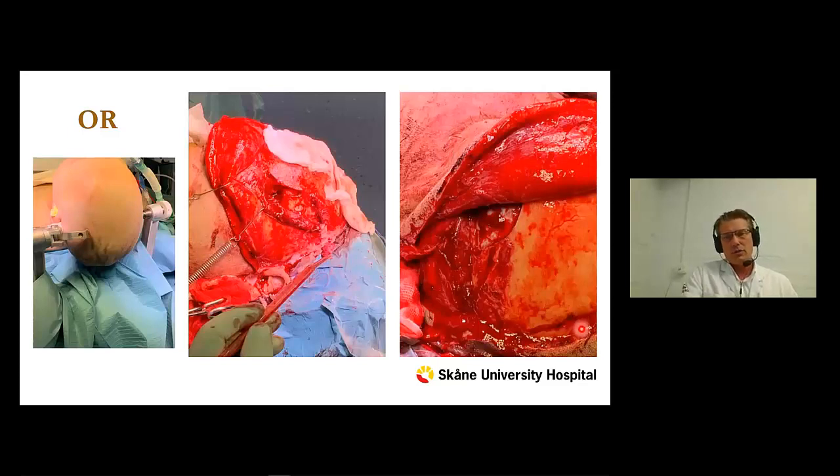While our resident and the ENT surgeon were dissecting and unfolding the cheekbone, I had the ability to pre-bend the titanium plates, thereby saving time during the operation. It's very difficult to bend them freehand, and it never looks good on the CT scan postoperatively.